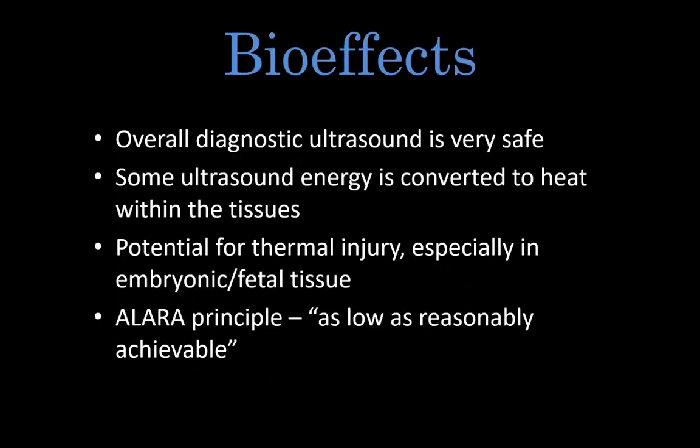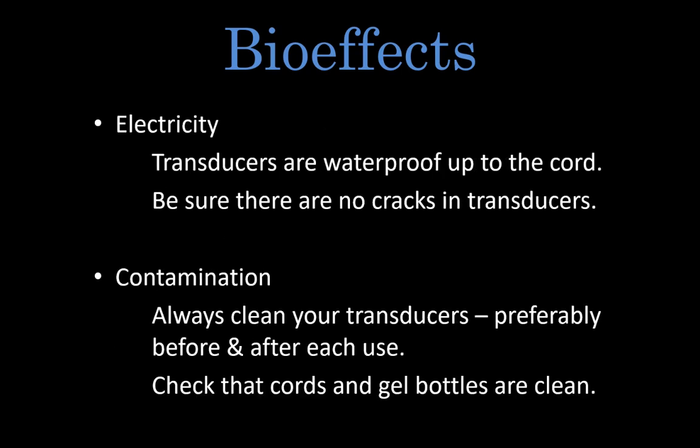The last few slides discuss bioeffects. Overall, diagnostic ultrasound is very safe. However, remember that some ultrasound energy is converted to heat within the tissues through the process of attenuation. This is the reason we don't use Doppler to look at fetal heart rates as well as embryonic tissues, as they are in a very delicate developmental period. We refer to the ALARA principle, which stands for as low as reasonably achievable, regarding ultrasound energy and actual time of imaging.